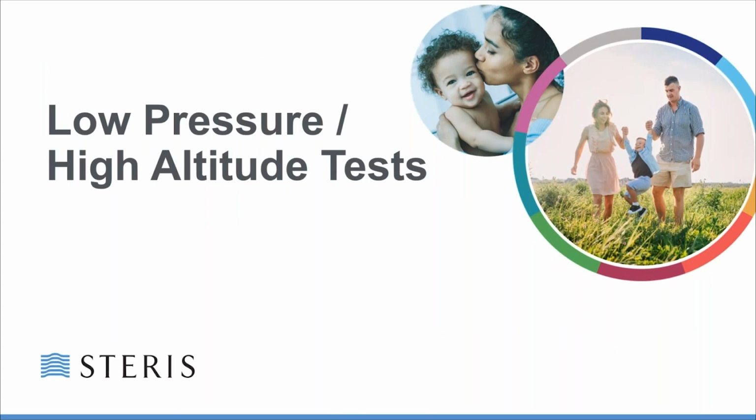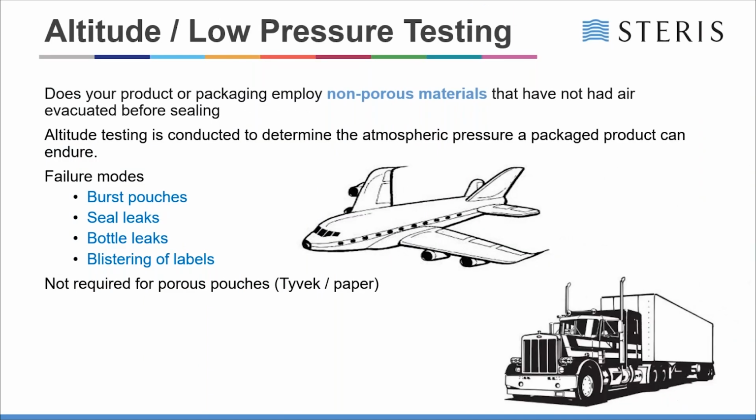Low pressure testing. Again, this is very important to be able to look at and understand what is required here. A lot of people think that altitude is only applicable to air freight, and that is absolutely not the case. If you're driving a truck over a high mountainous area, and it doesn't even have to be a high mountainous area, or you're driving your car over a high area, your ears will start to pop. That's the effects of altitude.